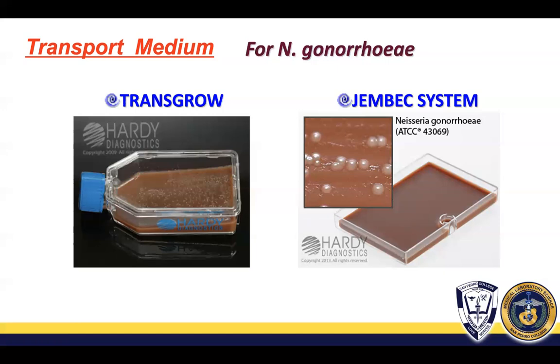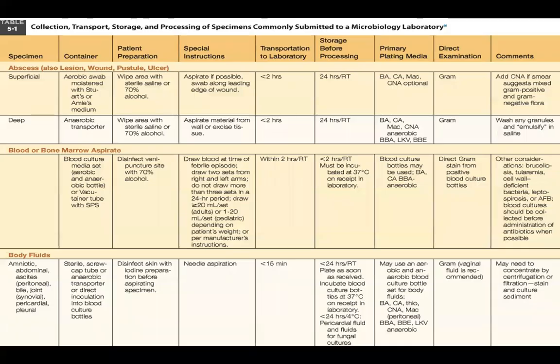Okay. So this can be incubated at 35 degrees Celsius for 24 to 48 hours. Incubated, not refrigerated.